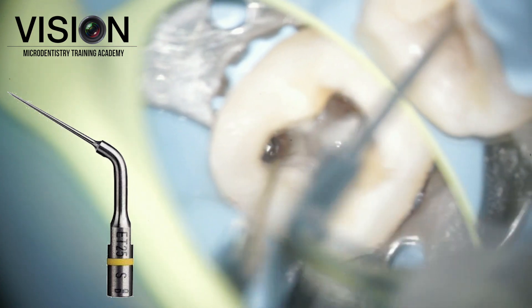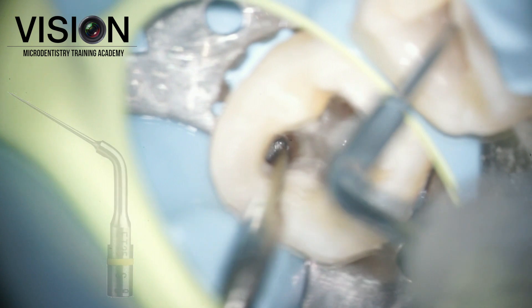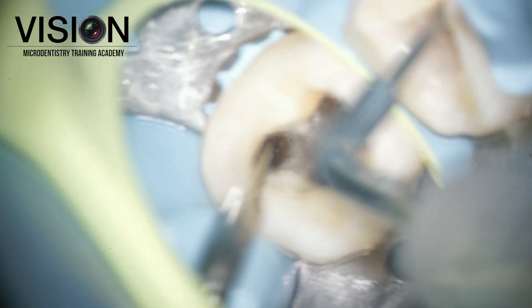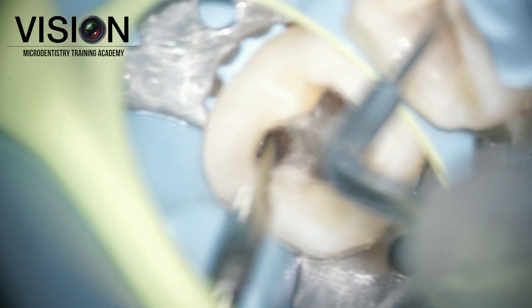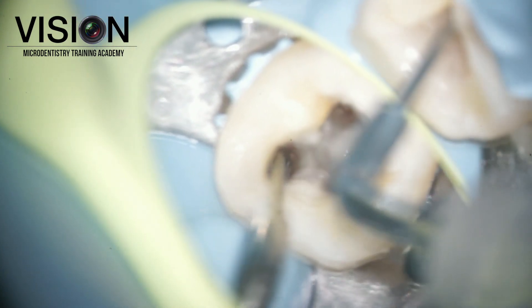Since the fragment was visible — the head was visible — I did not have to do much work to expose the head, but I did have to loosen it up because the length of the fragment was significant. So we used ultrasonics around the instrument to try and loosen the head.